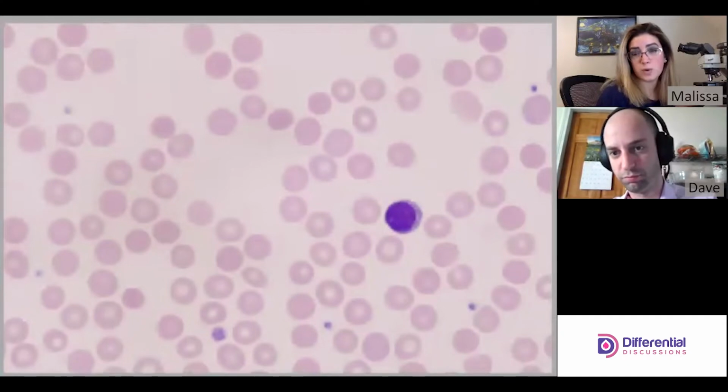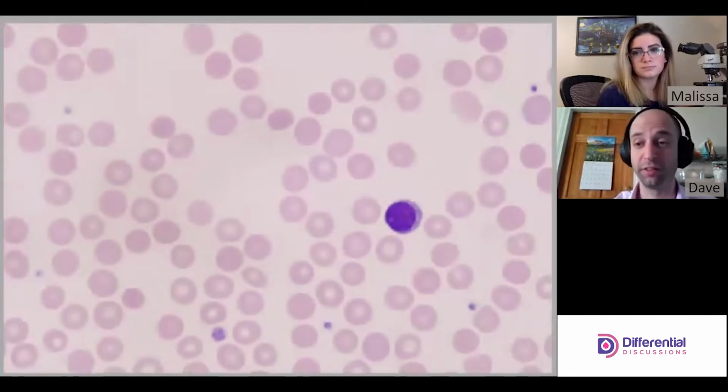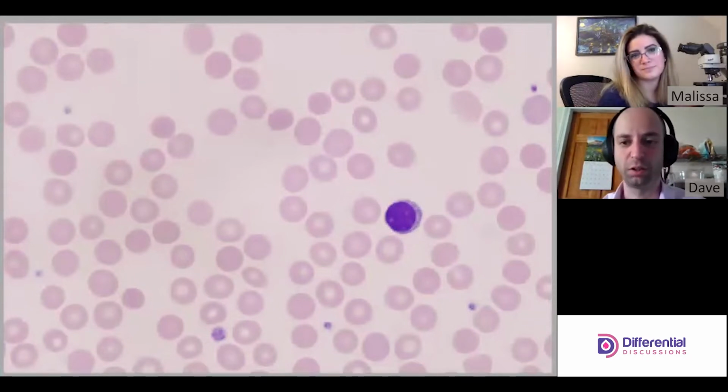And for reference, we're on 100 oil, the appropriate objective for differentials. In certain circumstances, with higher levels of training, an experienced microscopist might use 50, but 100. Don't cheat.